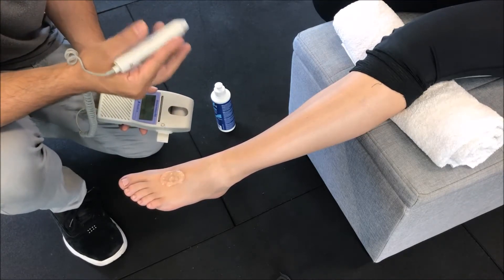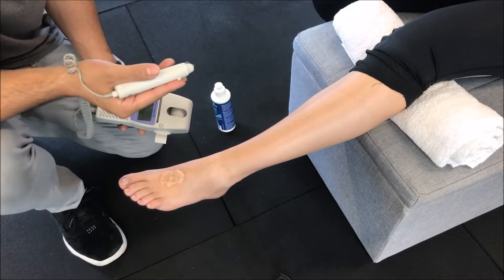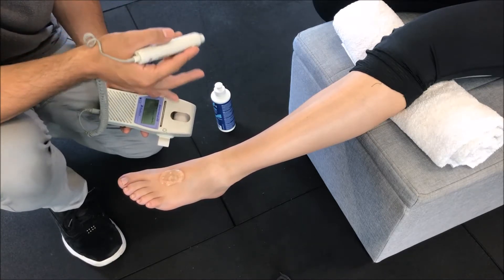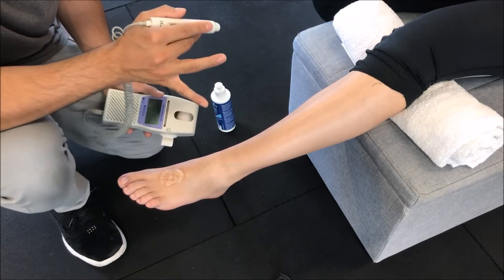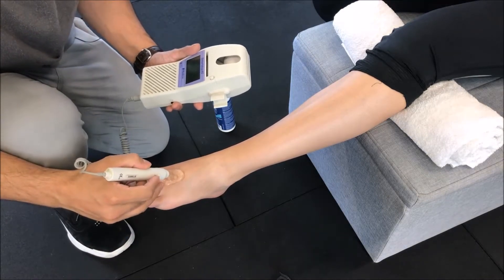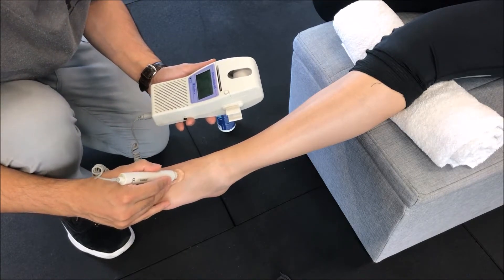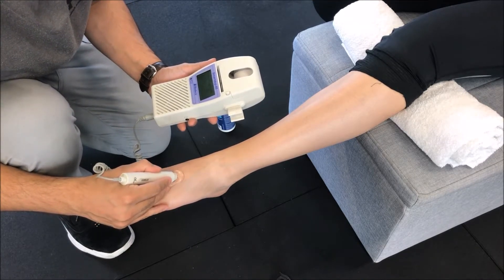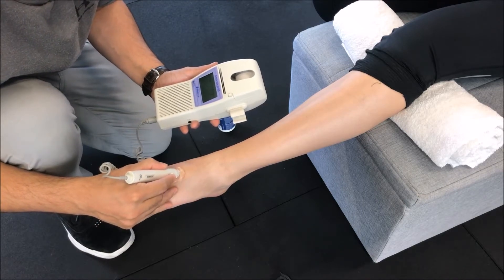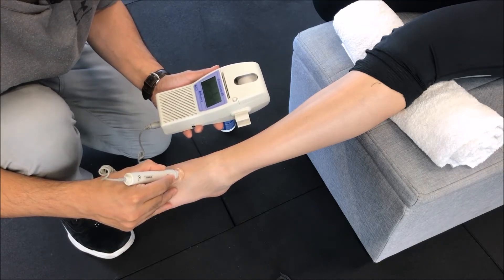If healing is compromised, there is a higher risk for infection. But on the other end of the spectrum, if the healing processes are good, even if they were to get a cut or lesion this far away from the heart, we know they have the ability to heal. I'll now try to find Jess's pulse.